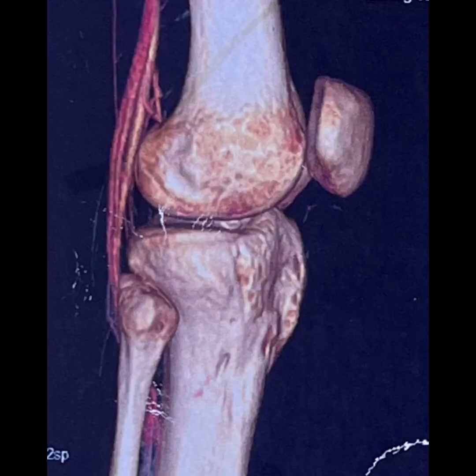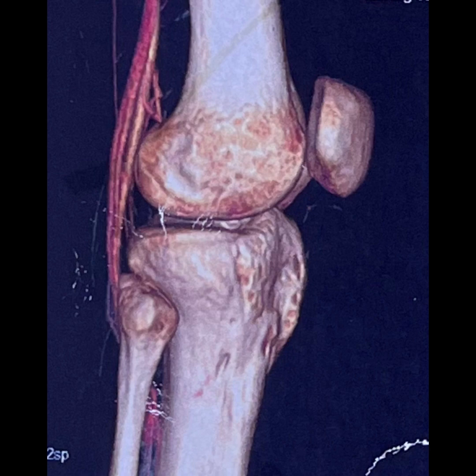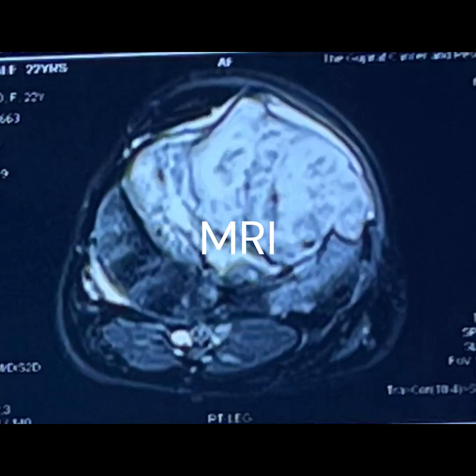The surgery is performed under general anesthesia or spinal anesthesia. The patient is positioned to allow optimal access to the tibia, typically supine. A tourniquet is often used to reduce blood loss and allow better visualization of the cavity.